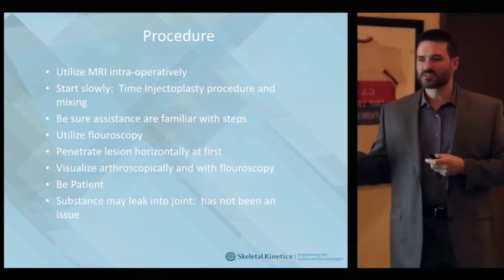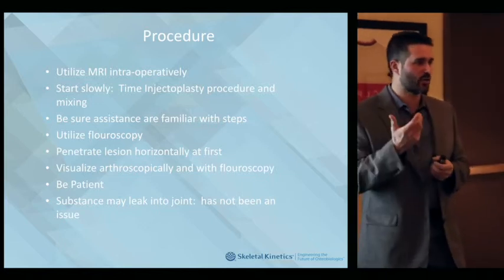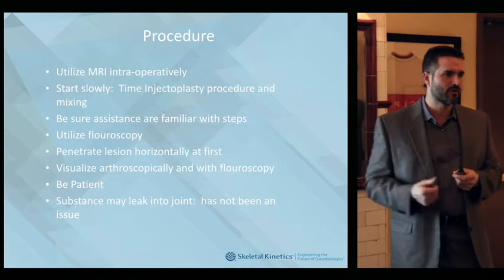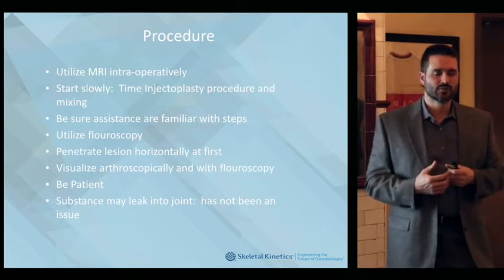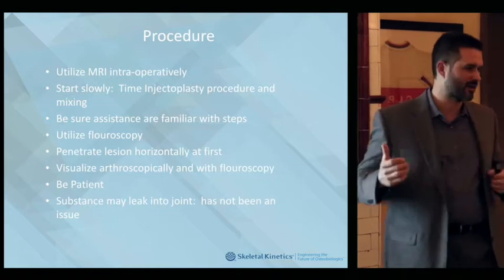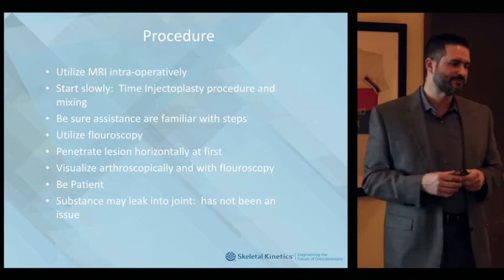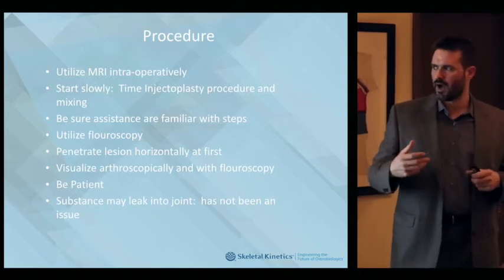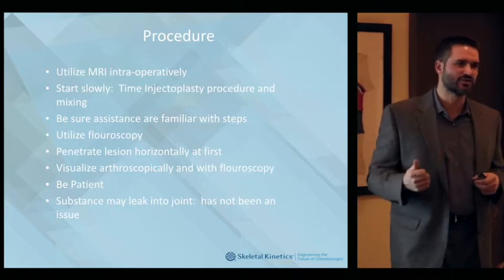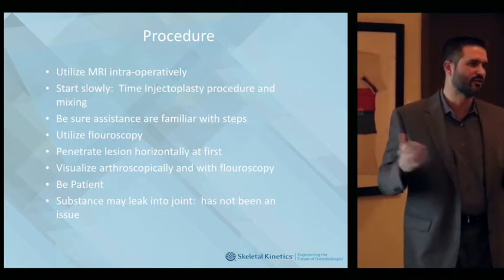And then arthroscopically, I always visualize, because some of that will leak into the joint. I've had probably 3 or 4 that have done that, because there is a crack in the bone. With experience now, I don't pressure, I don't just jam it in like before and I'm done. Slowly do it, watch it, let it harden a little bit before you push, like maybe back out as you do it. Some does get in the joint, I just flush the joint and I've had no problems. Patients aren't complaining. The 3 that it's happened to, they're doing great.